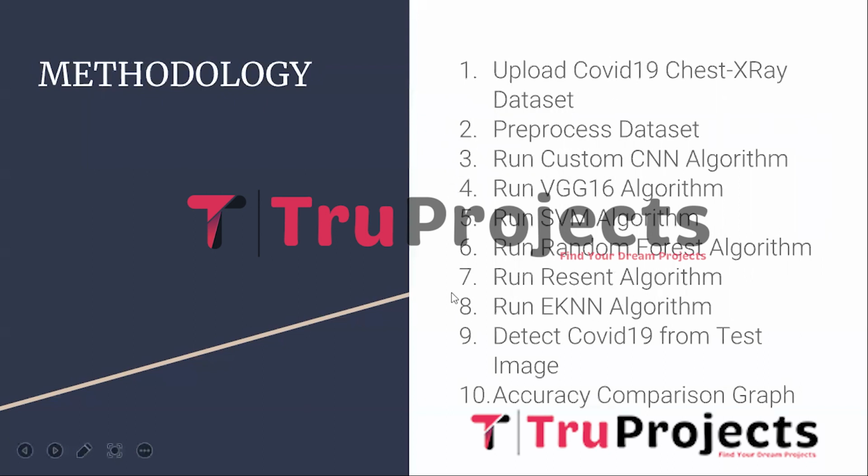These are the modules that are implemented to build this project. Upload COVID-19 chest X-ray dataset. This module allows the users to upload the dataset consisting of chest X-ray images related to COVID-19. These images will serve as the basis for training and testing the detection system.